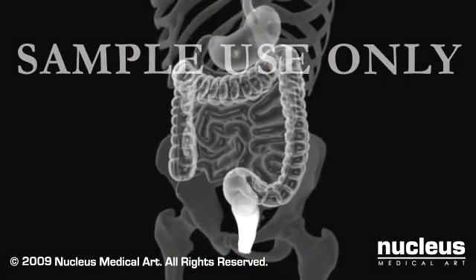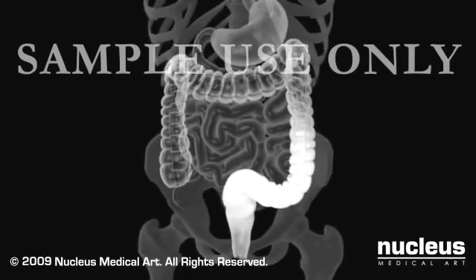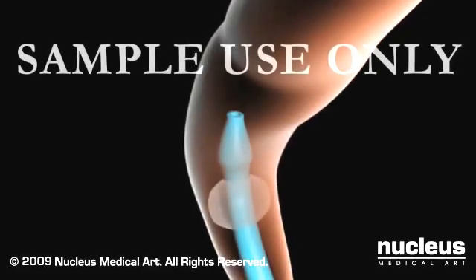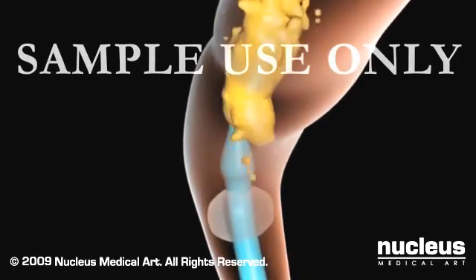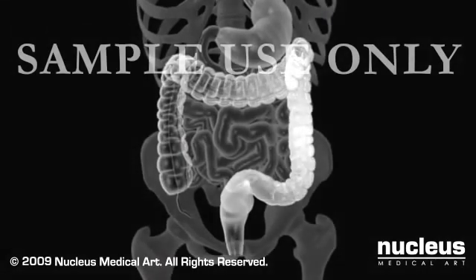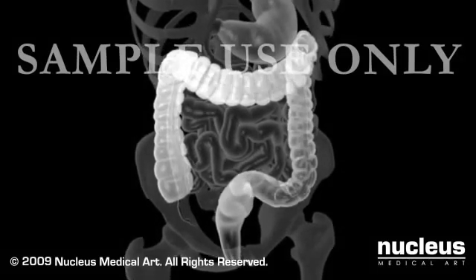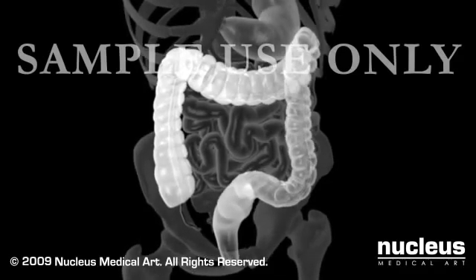When enough barium has flowed into your colon, you'll be asked to try very hard not to expel any of it while x-rays are taken. A tiny balloon attached to the tubing that carries the barium may be inflated to prevent any barium from leaking out during the exam. While the x-ray pictures are being taken, you'll be asked to roll from side to side or to stand up. This lets the barium flow to different areas so that sufficient x-ray images can be obtained of your entire colon.